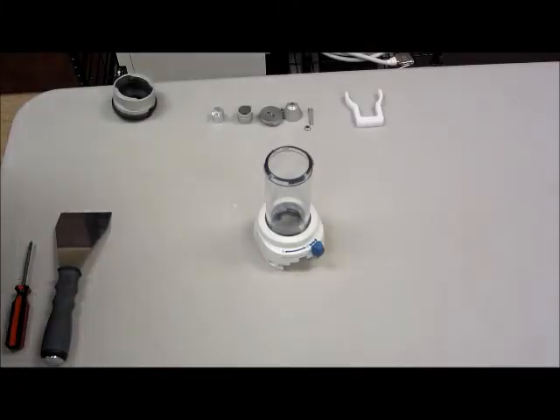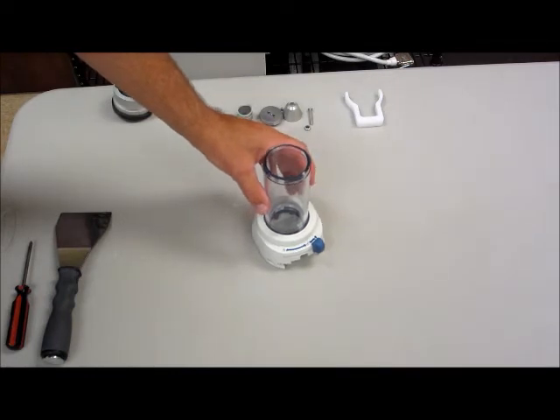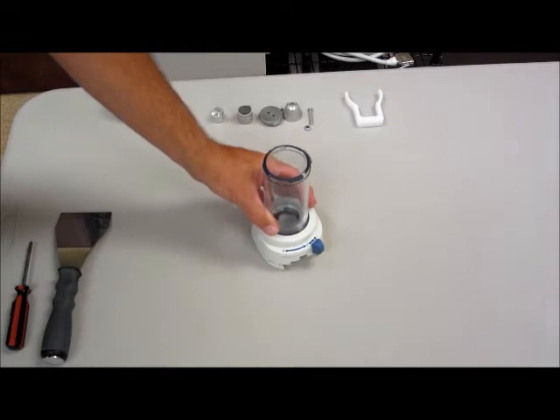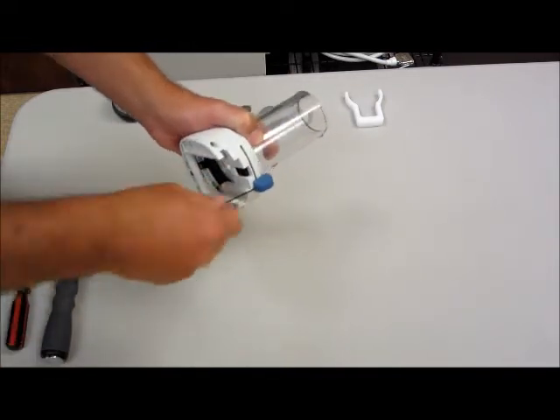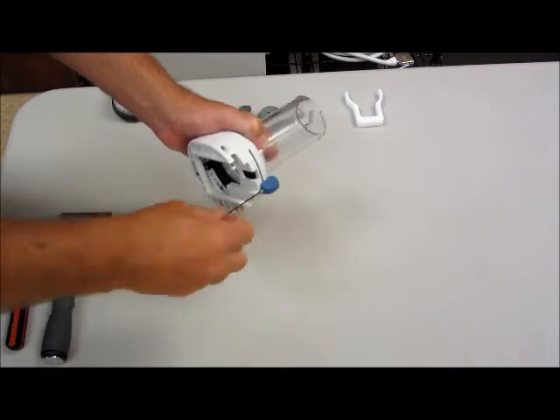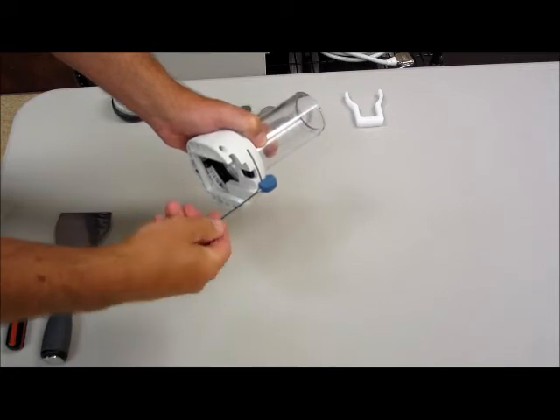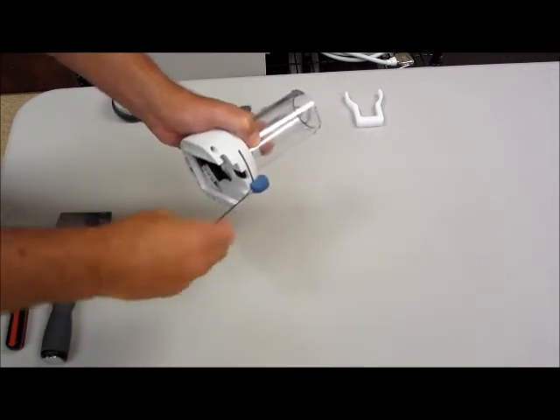Step number three details disassembly of the 200 ml faceplate so that we can continue installing the KOUR adapter. The first thing you're going to do is remove the set screw that holds the blue button in place. This is done utilizing a 1/16th inch Allen wrench. So we're going to fully back that screw out.